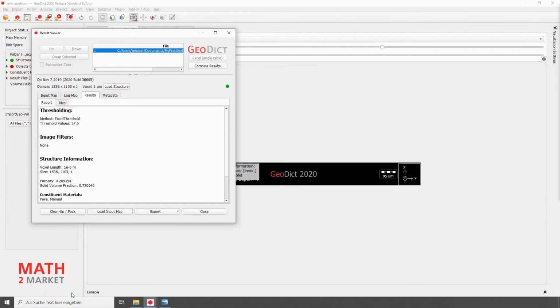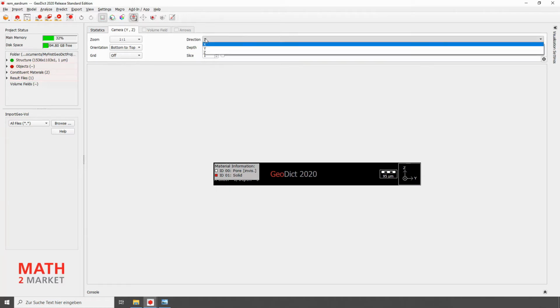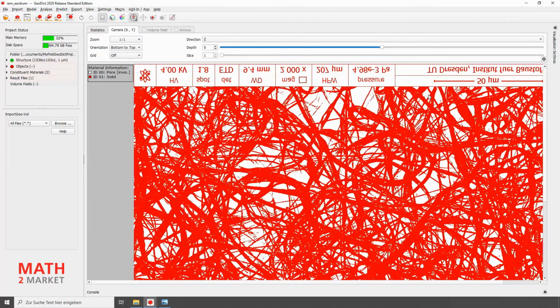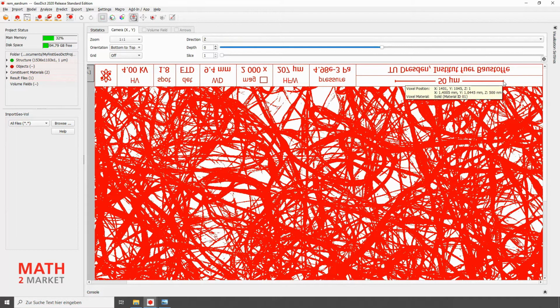As you can see, a so-called GeoDict Result Viewer window opens, where you can see the parameters that have been set listed again. Since GeoDict is in the 2D view in X direction, we have to change it under camera direction to Z direction. Here we can see the fibers as we have segmented them. And very importantly, we can see the scale bar up here as well. We will now use this to determine the correct voxel length.